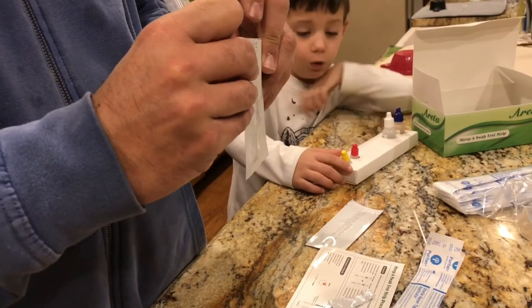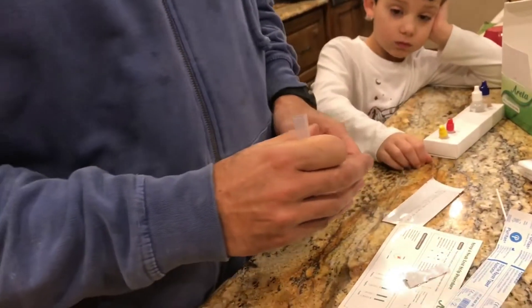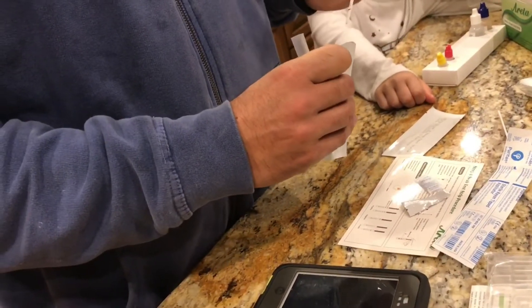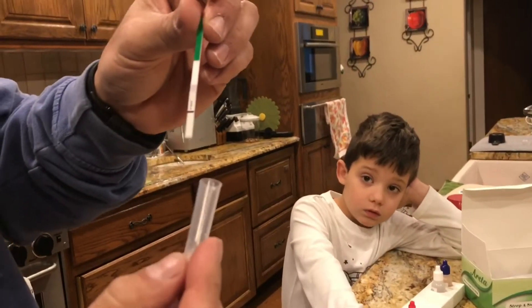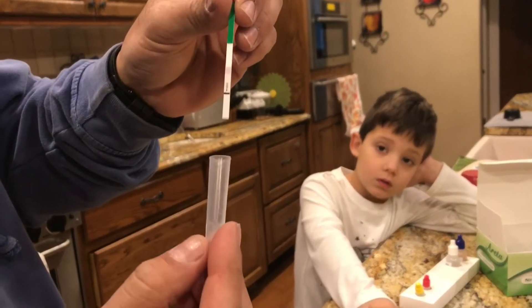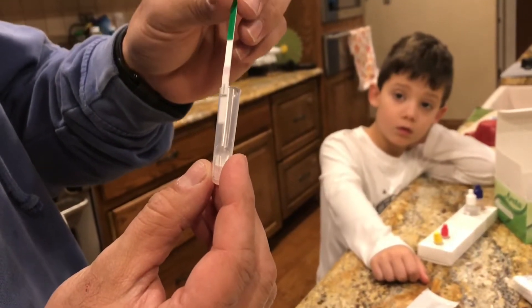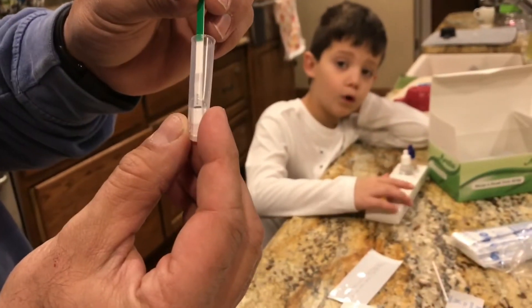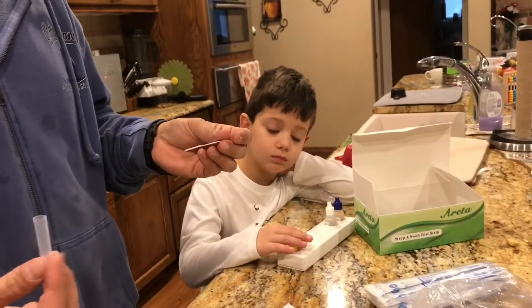This test is specifically for strep — it's not going to give you any results for influenza. I'm not a big believer you can do much about influenza personally. There's the black line on the test strip, and what they're saying is don't dunk past the black line. You're only going to put this in for five seconds — it's a little sponge and it's going to wick up the fluid.